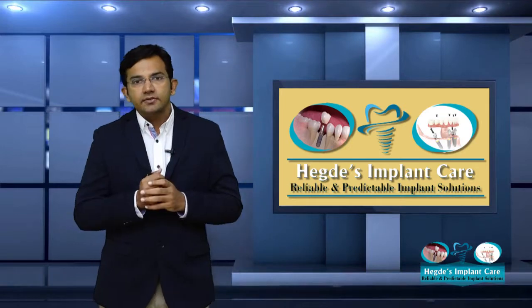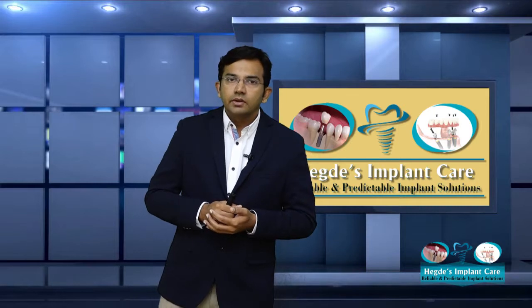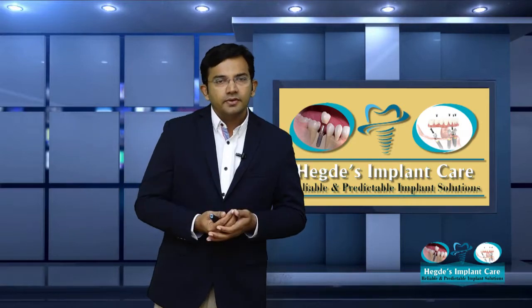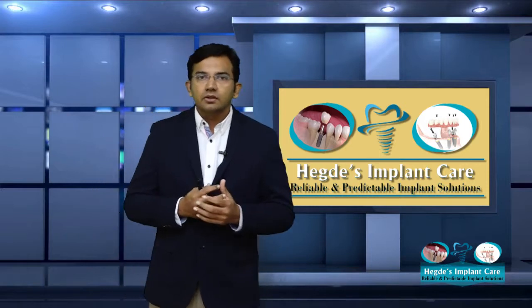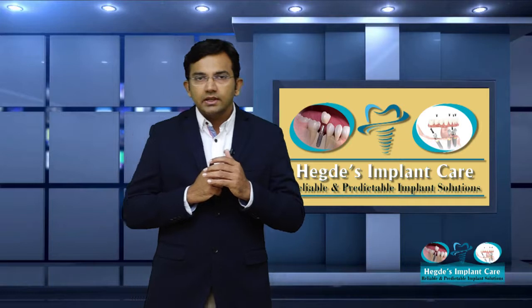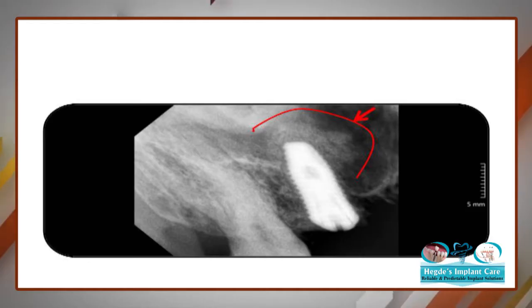Once I have done the sinus lift, you can see the graft being placed. Generally, I would prefer to place a xenograft. In this particular case, I have used BioOS, which is a xenograft, along with the bone chips that have been collected. Along with that mixture, I have done the bone augmentation there. I have slightly placed the graft inside, tapped it, and then placed the implant. You can see the final picture there.